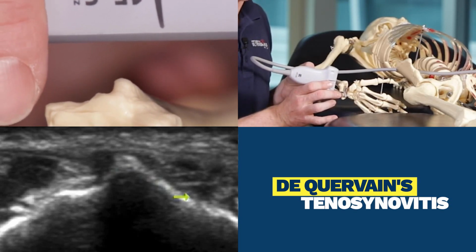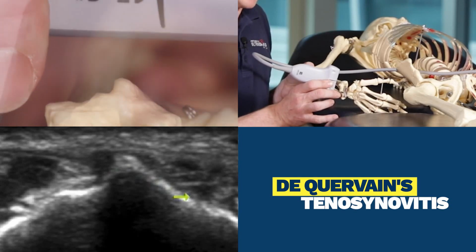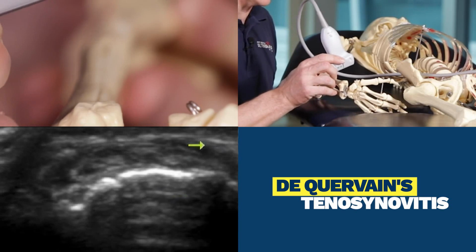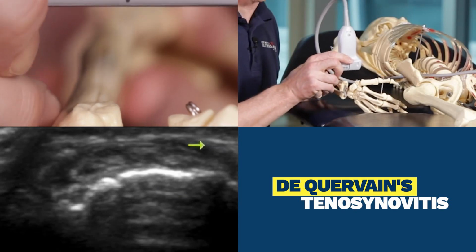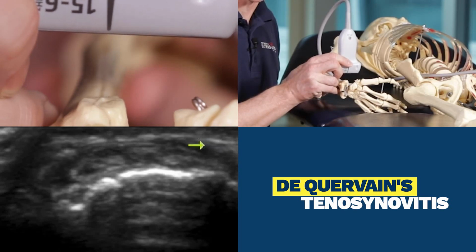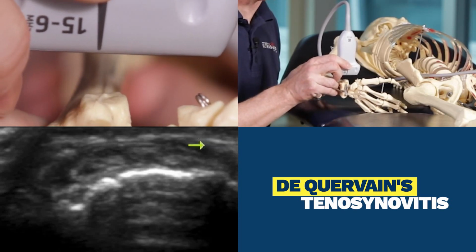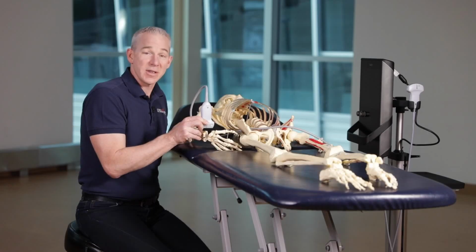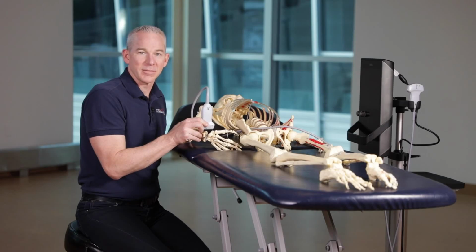The movements are then going to be coming around the corner towards the thumb and looking down at the radial most aspect of the radius. Now the area of interest is going to be the collagen tissue just sitting on top of the bone at this spot. And so this is how we scan the first extensor compartment of the wrist.